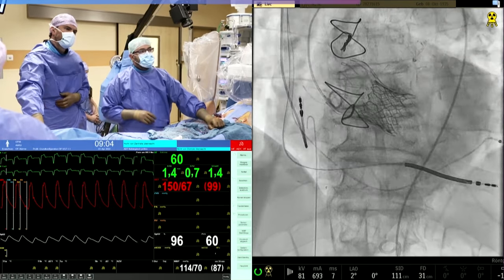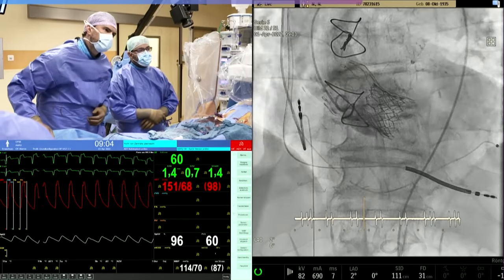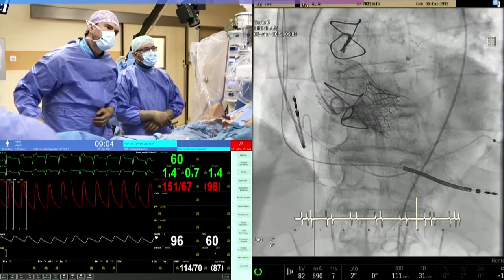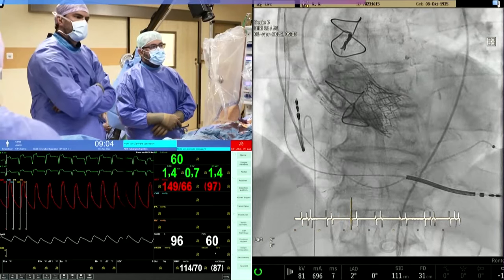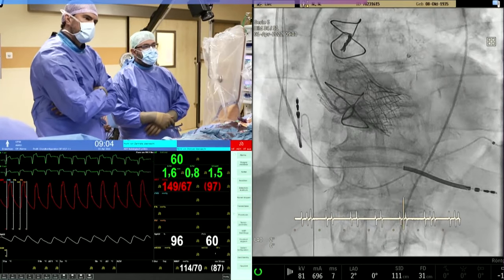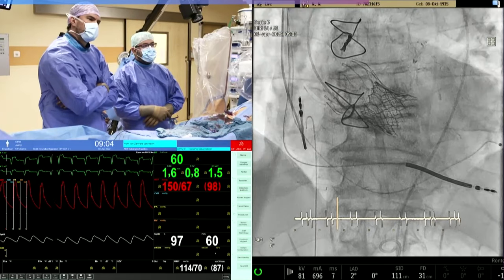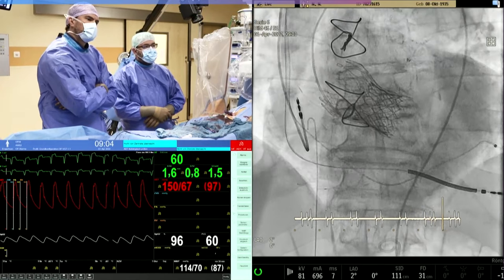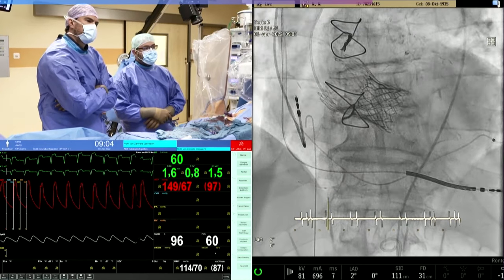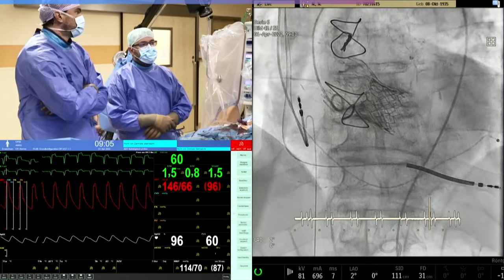Perfect. I mean, it looks quite good. We ended up a little bit higher than we wanted, but I think it's still fine. You can appreciate here the filling of the right coronary artery. You can also see the origin of the right coronary artery due to the stents. So it seems to be exactly above the upper border of the Sapien frame, or maybe originating from the first row of cells of the Sapien frame.